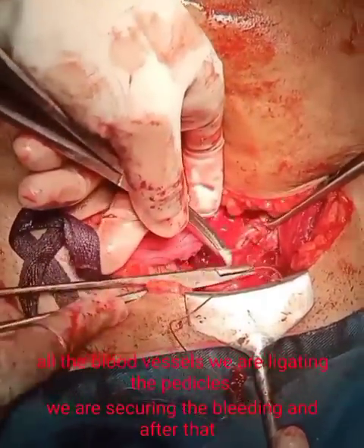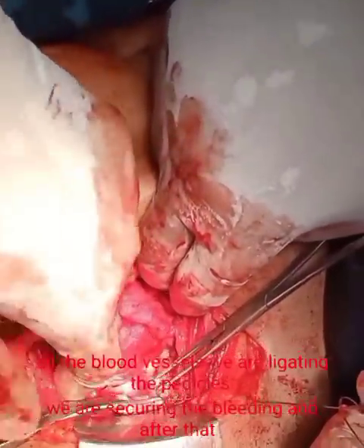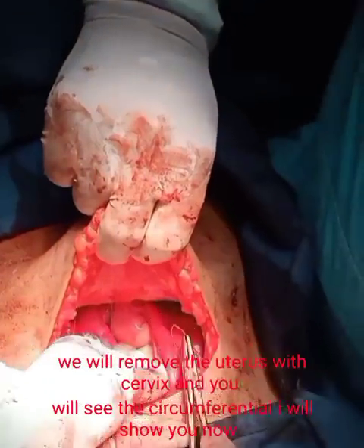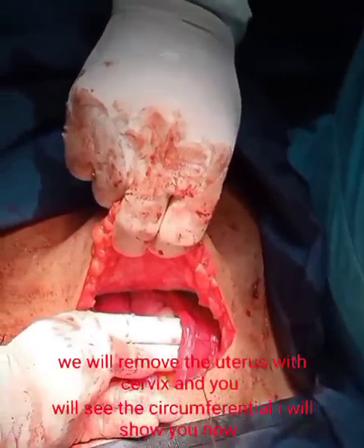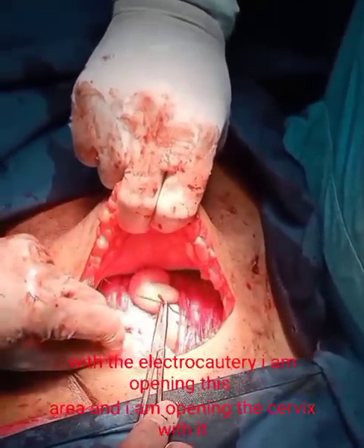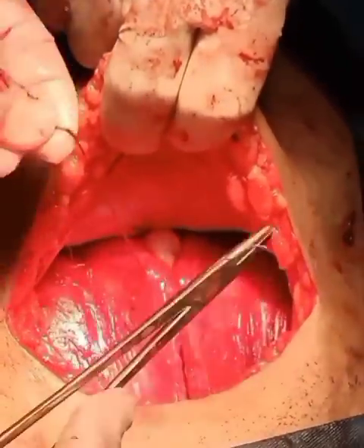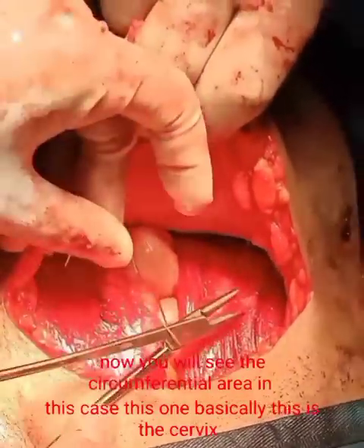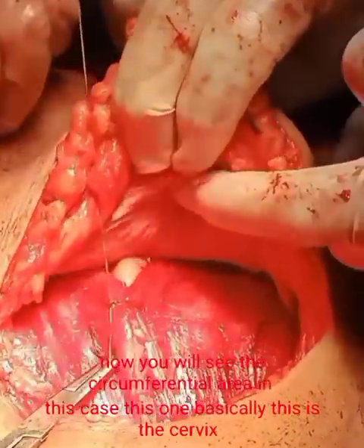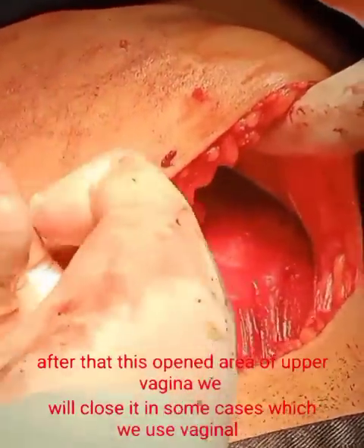We will now close the incision in the reverse order of how we opened. We are closing the vaginal stump, then the midline with catgut taking 2 to 3 stitches, being careful as the gut lies just behind. We then close the rectus sheath carefully — it has two layers and we will close both, otherwise there is a risk of hernia formation.